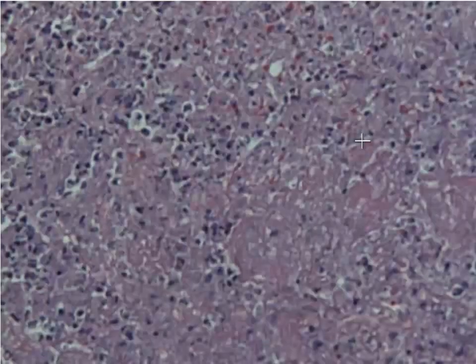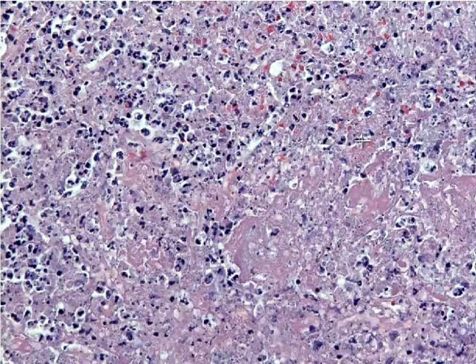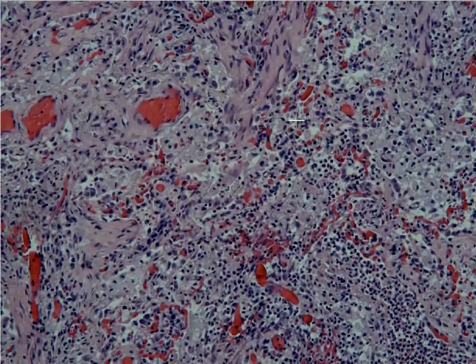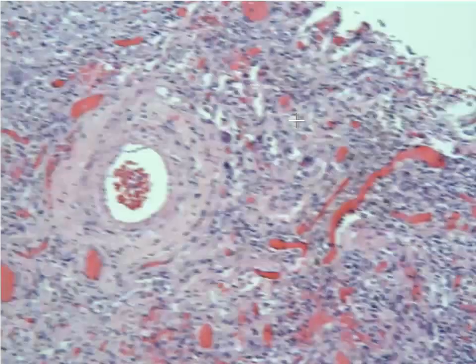Now, of course, this doesn't look all that impressive, just some chronic inflammation, but right to the south from that, you can see our old friend, acute inflammation and necrosis. And so here you have a bunch of fibrin and blood, as we saw in the esophagus biopsy, and scattered neutrophils. So this person had an acute infection in addition to having one that had been going on for a while. And what this case actually turned out to be was a case of CMV pneumonitis.